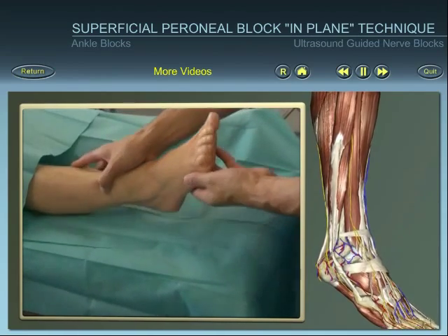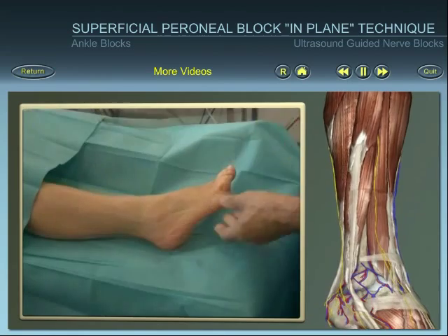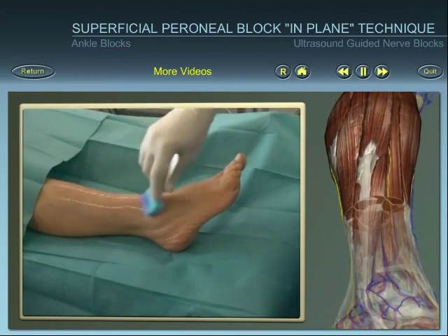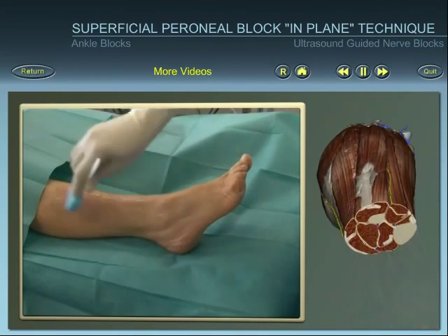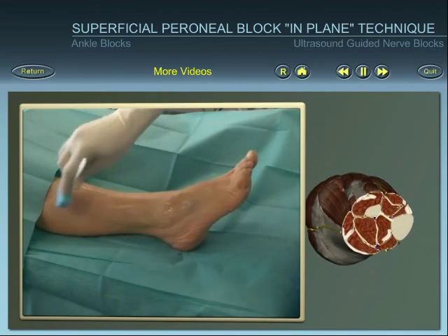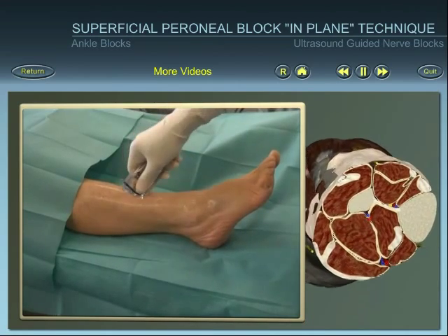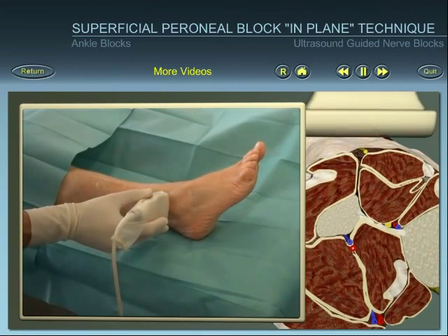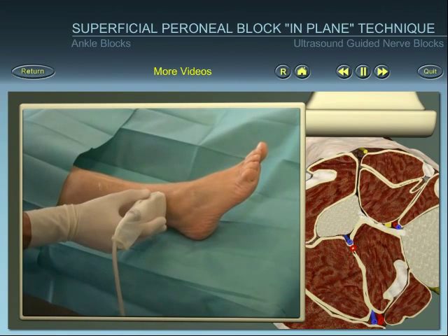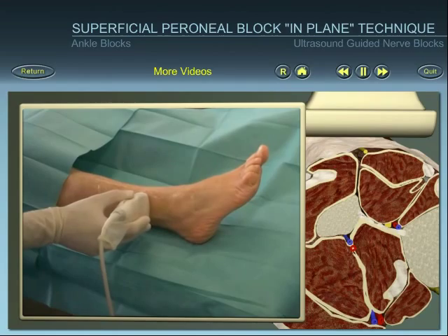Position the patient and identify superficial landmarks. After skin disinfection and using an aseptic technique, place the ultrasound probe. Align, rotate and tilt the probe to obtain the best view of the superficial peroneal nerve.